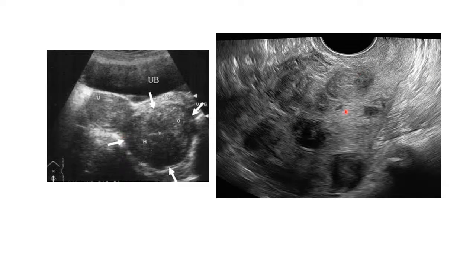Look closely here. You can see there are multiple lesions, all of these ones. These are multiple uterine fibroids. This is one of the problems in gynecology, because imagine if a gynecologist is going to do a myomectomy to remove all these fibroids, they have to cut all these pockets. These ones are very complicated to manage. At times, the only remedy could be a total hysterectomy where they remove the whole uterus, because you can see they are very diffuse, multiple uterine fibroids.